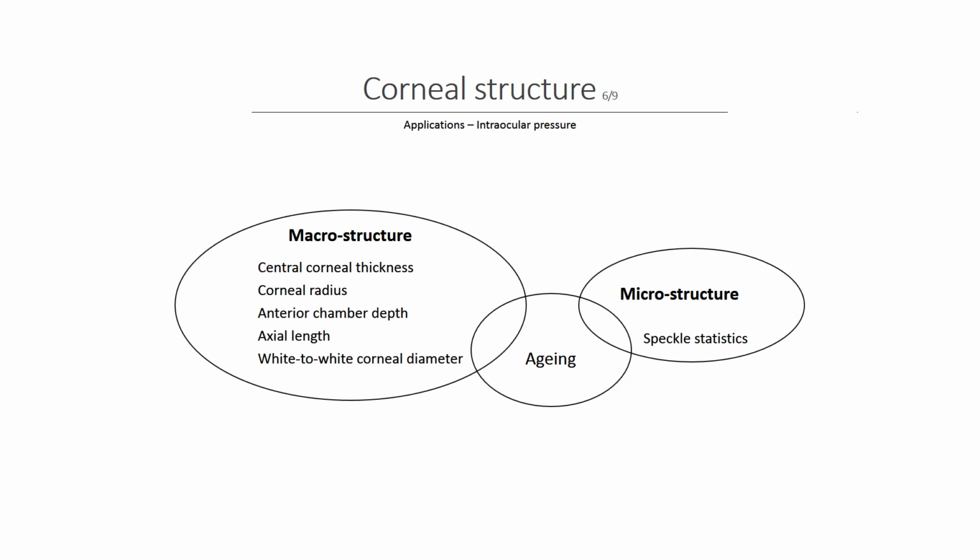The last study using corneal speckle was focused on the role of macro and microstructure on applanation tonometry. Tonometry is widely used as the main screening tool supporting glaucoma diagnosis. Still, its accuracy could be improved if full knowledge about the variation of the corneal biomechanical properties was available.